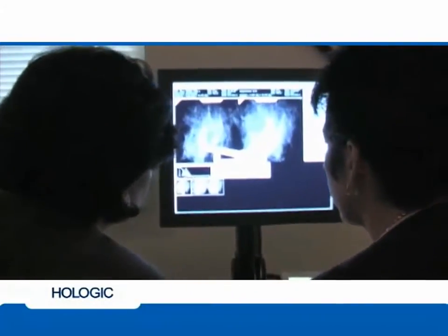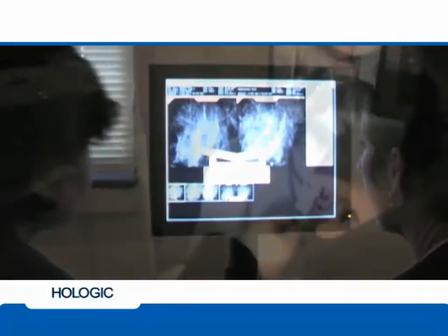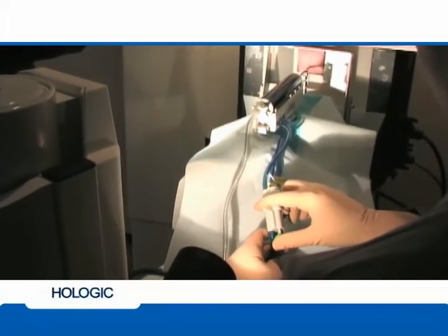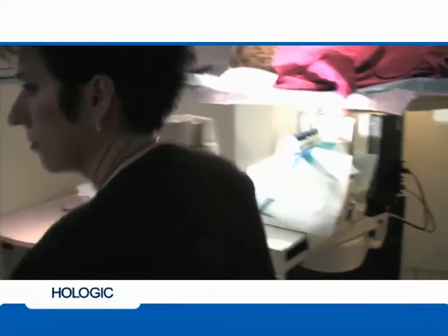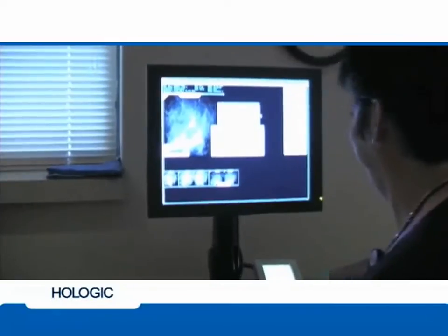Activate the view stage cursors to ensure that the injection of anesthetic has not caused any lesion movement. The device is then fired by fully depressing the green button on the remote firing mechanism, advancing the needle 23 millimeters.